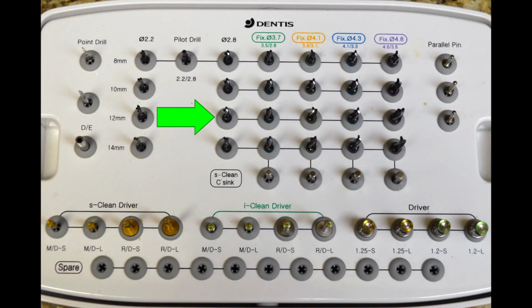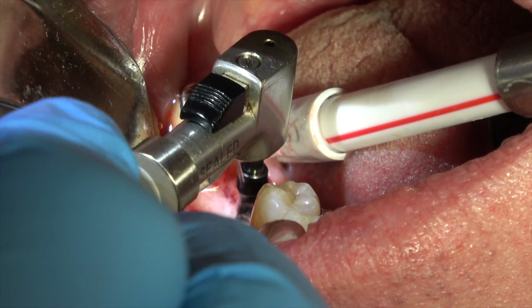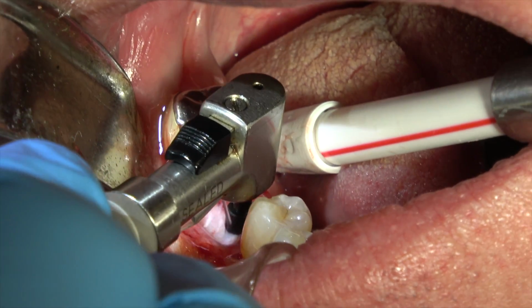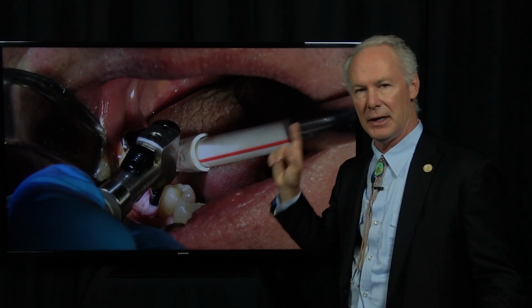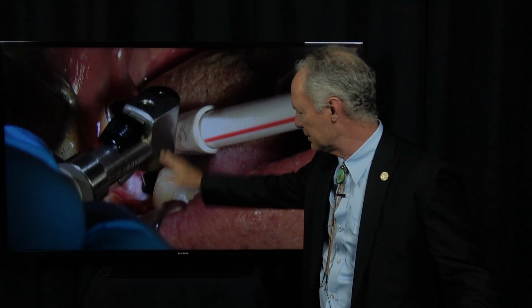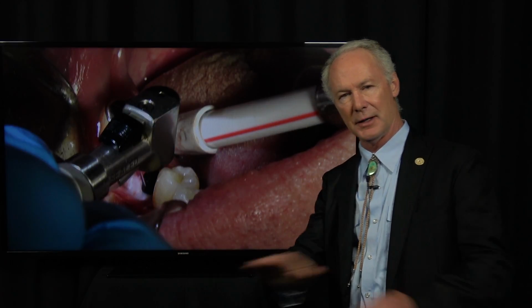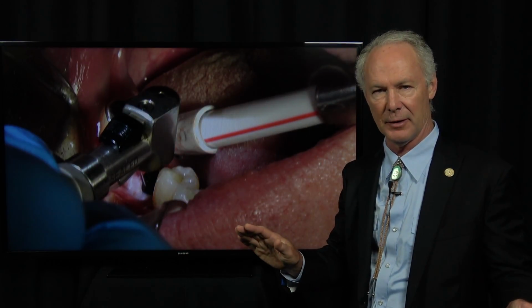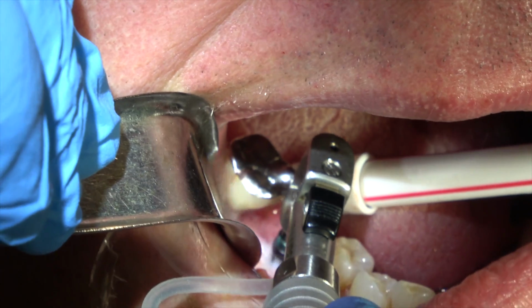Then you're just going down the line, and I take the periapical radiograph with the drill in the osteotomy. And then you can use the top part of the drill to be sure you're in ideal alignment. See, so I go till that sleeve or that shoulder contacts the alveolar crest, and I know that's exactly 12 millimeters. It's perfect. See, and now we're going to the next one.